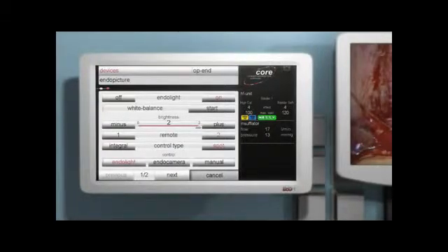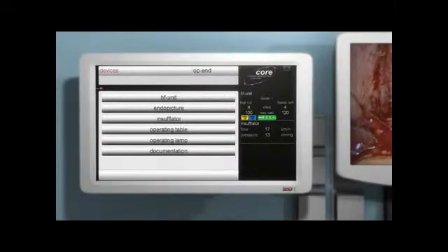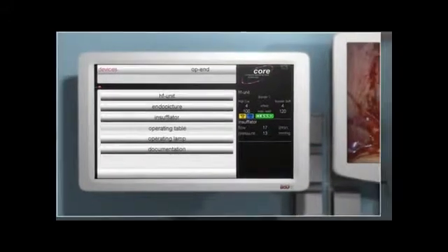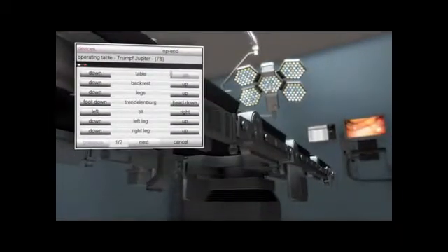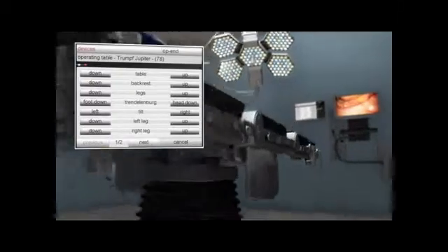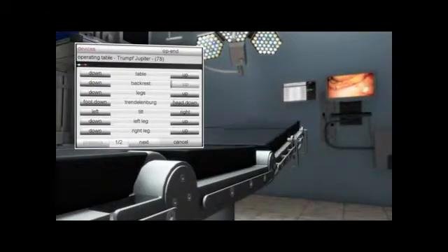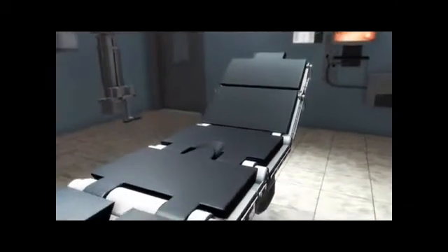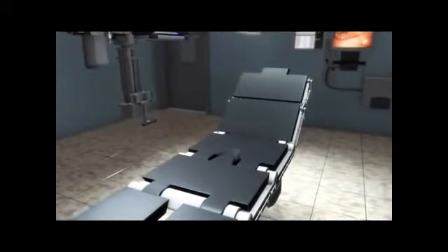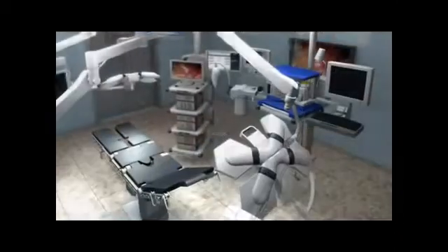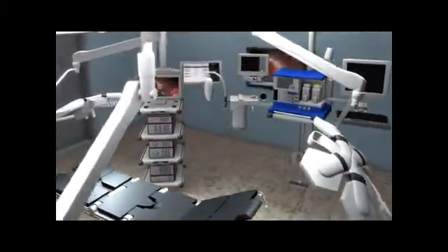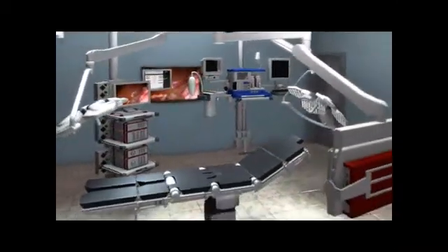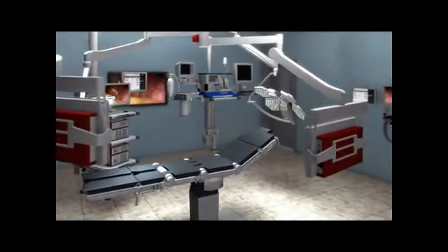There are no cryptic symbols — just clear commands that can also be spoken: 'Operating table, table up, back up.' But doesn't that only work with Richard Wolff equipment? The system works with any item of equipment that has the option of remote control. This operating table, for instance, is not a Richard Wolff product. Richard Wolff has integrated a large number of products from other manufacturers. And despite networking all the equipment, there isn't a tangle of cables lying around.